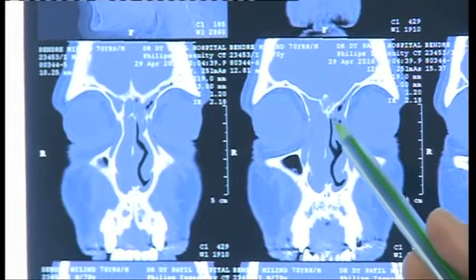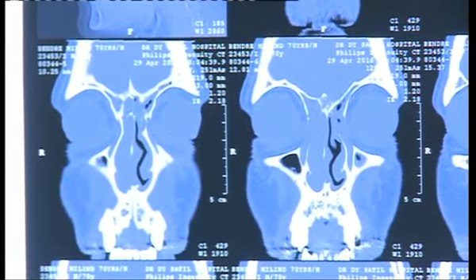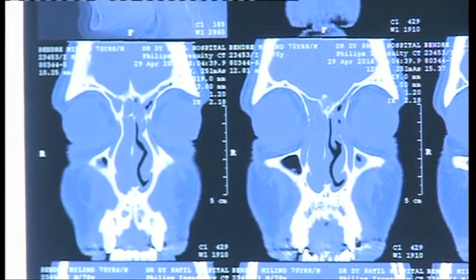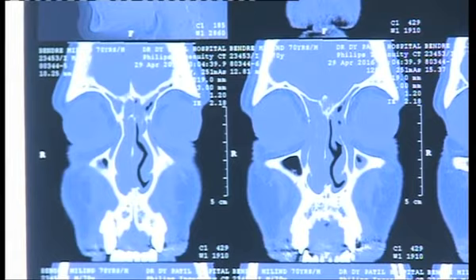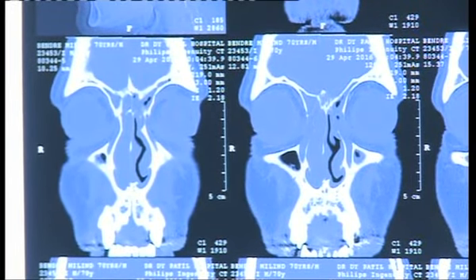So for me, the right will be easier than the left. This is one thing which you should always look at when you look at the frontal recess. Apart from that, everything has been discussed, and the way we deal with the scan, you will be seeing different varieties. But just one point to add: the left frontal is going to be more difficult than the right.